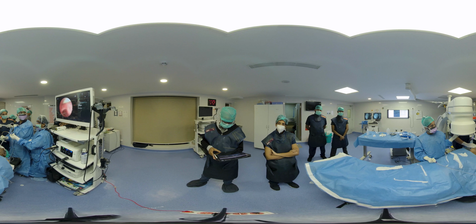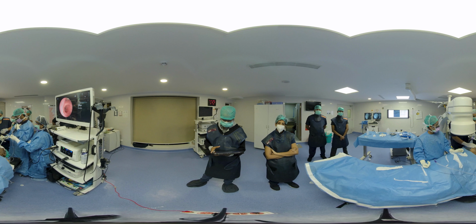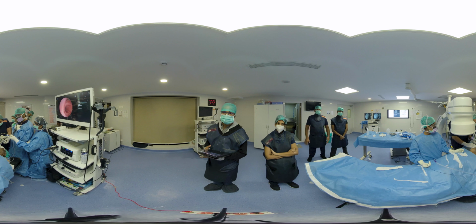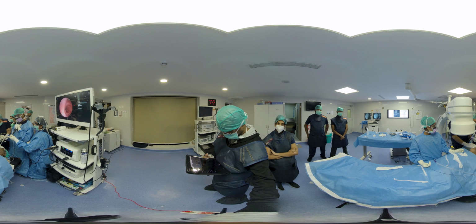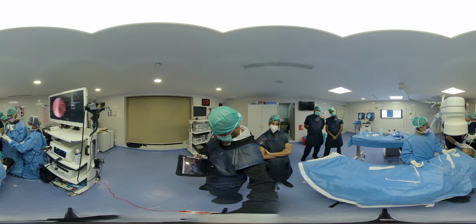You can see after manipulation we have placed the Fogarty blocker in the right upper lobe in the anterior segment. We generally place the blockers in the adjacent segment. And now you can see that we are securing the Fogarty in place.